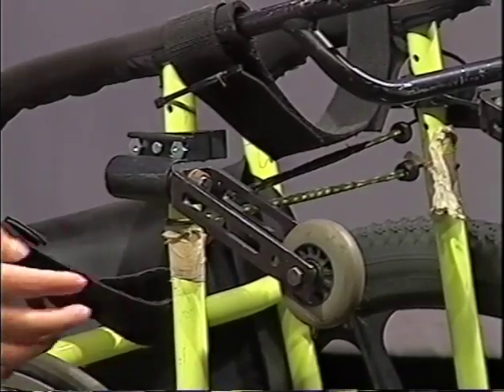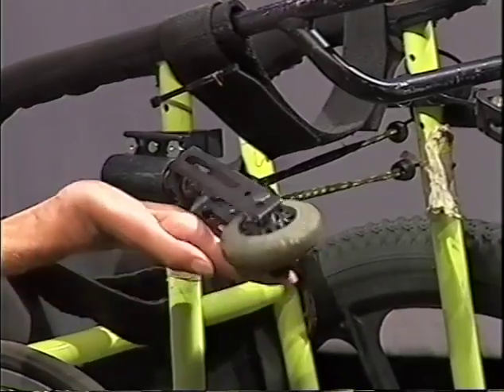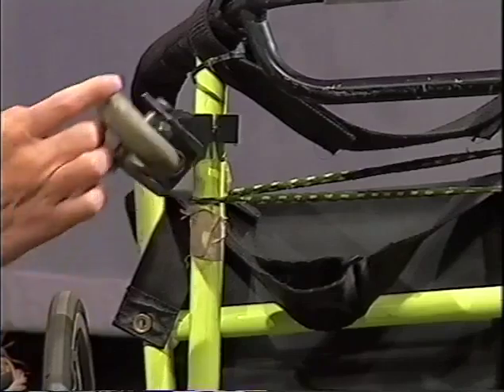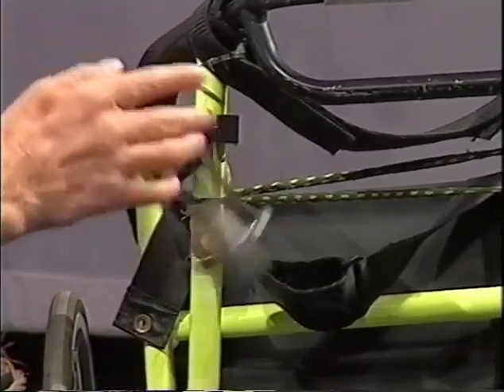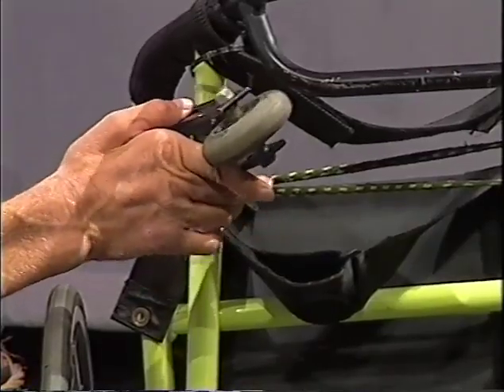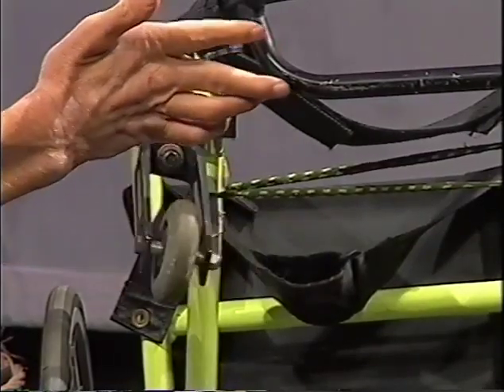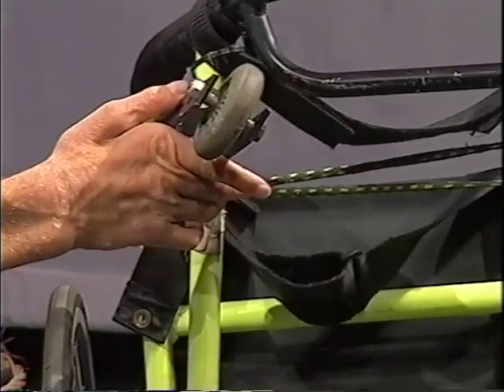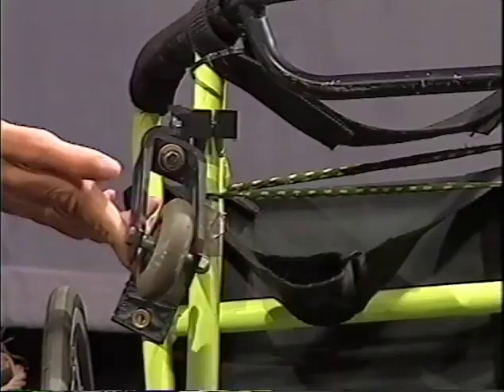When you consider the fork, you want to look at the sweep of it. And the sweep of a wheel is the circle that it turns as it spins around. If you have too much sweep, you can see that this chair just clears the front end, and that's about as tight as you'd want to get it. So this fork works well with this chair.